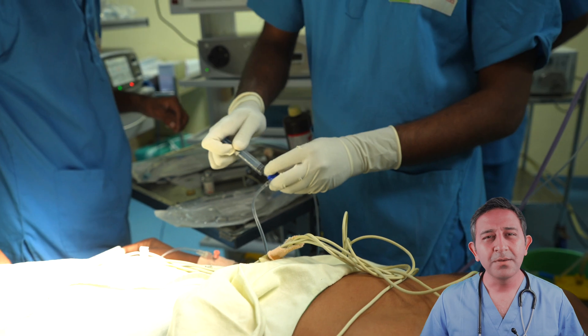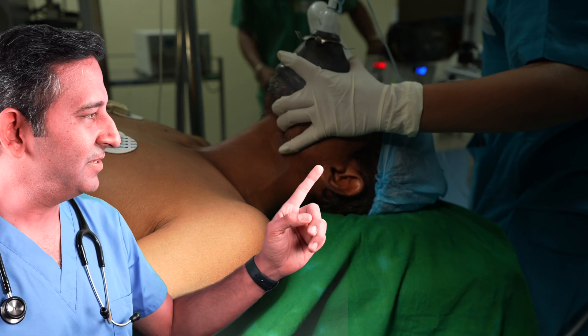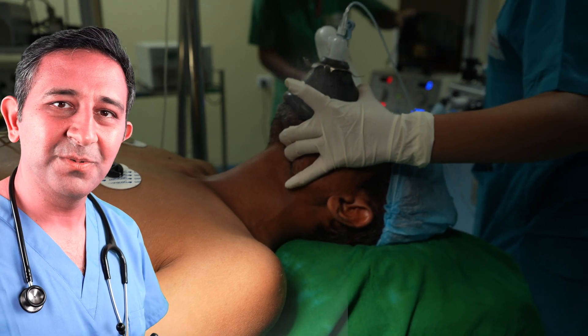Additional medicines are now being given to increase the depth of anesthesia. The mask is still on the face giving one hundred percent oxygen.